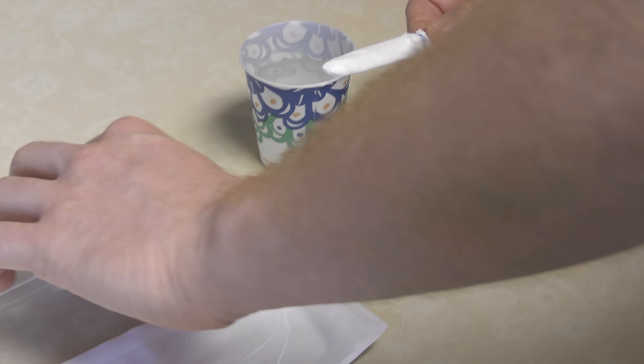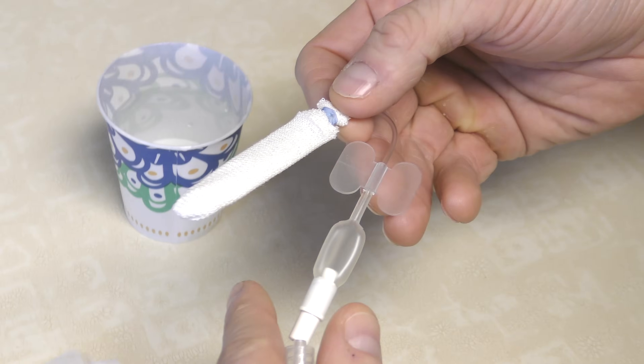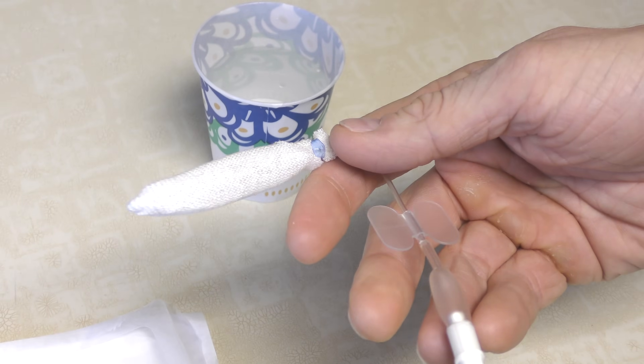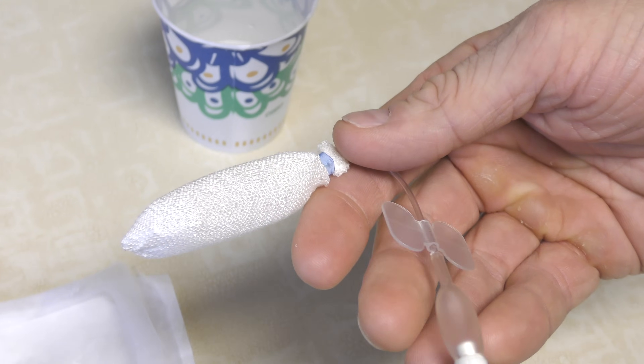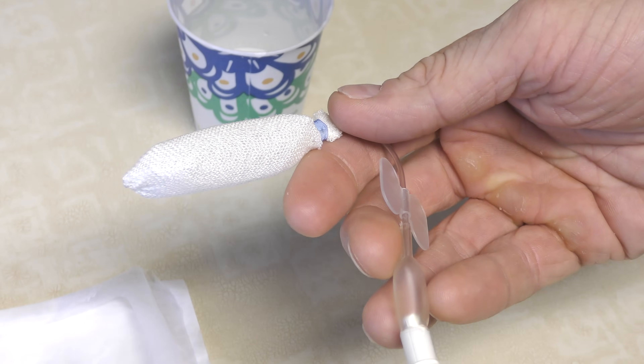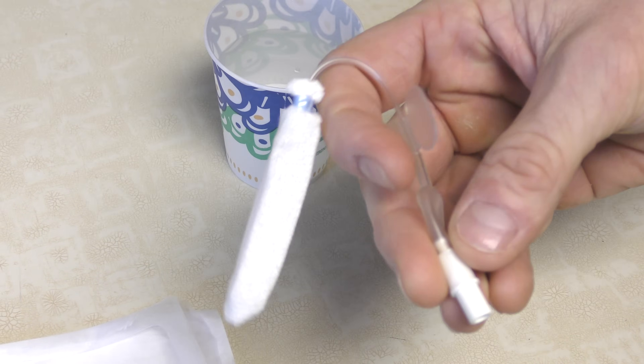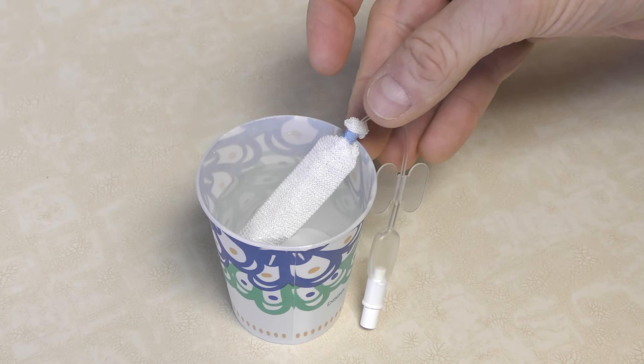Most modern nasal packs contain a balloon which can be inflated with a syringe in order to apply adjustable direct pressure to the site of the nosebleed. Prior to placement, the pack is hydrated with water.